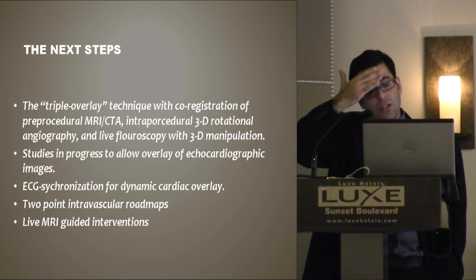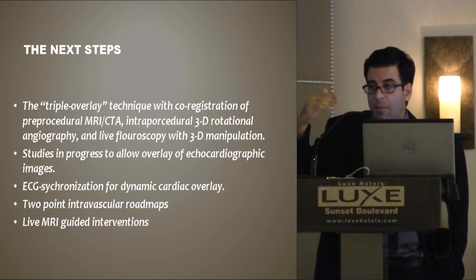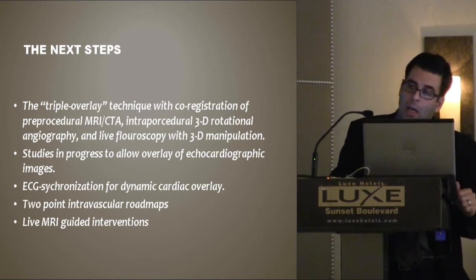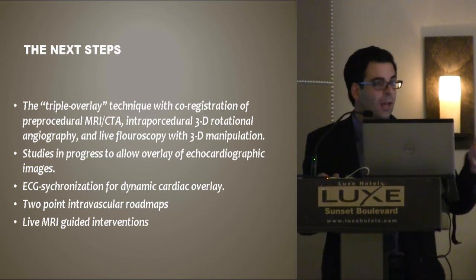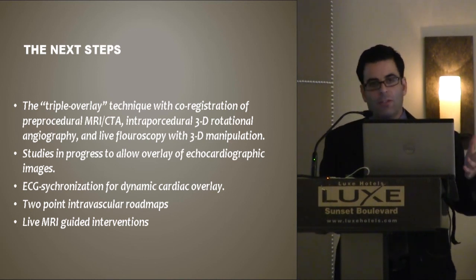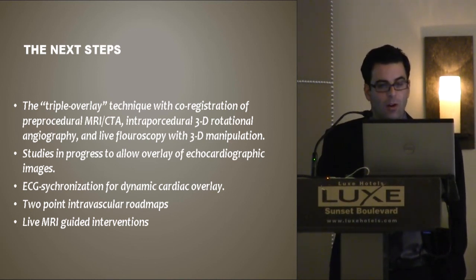ECG synchronization for all of these dynamic cardiac overlays, the ability to do intravascular roadmaps, and then really the holy grail here is going to be live MRI-guided interventions. I mean, that's going to be where this goes, where we don't have to use all this radiation, and we can use MR-friendly catheters and do our interventions.